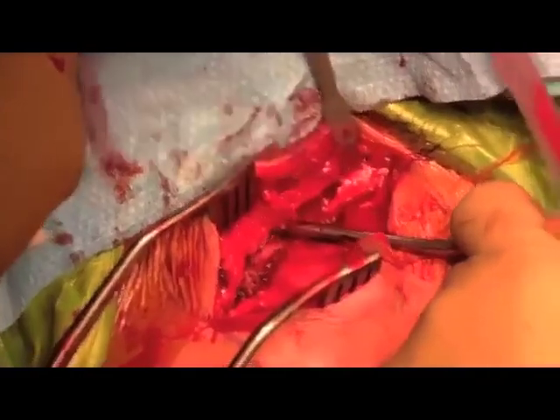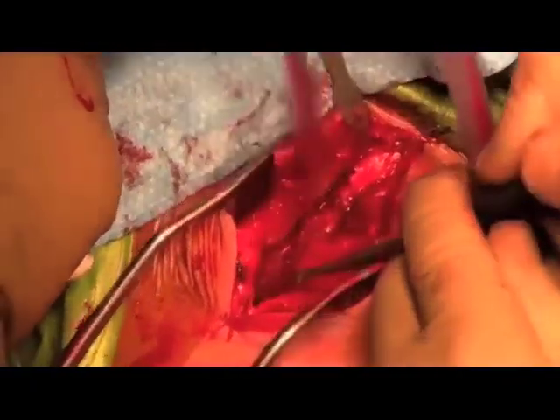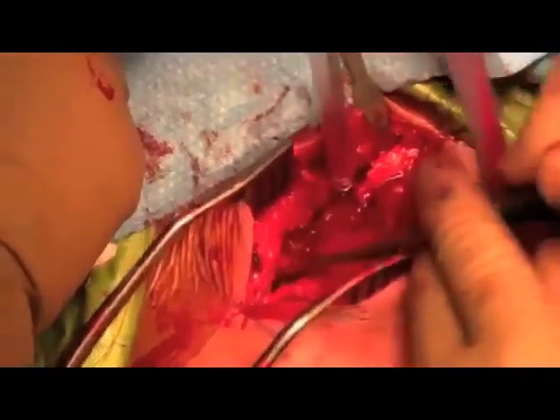A blunt elevator is used to elevate the soft tissue superiorly. Care must be taken to maintain soft tissue attachment inferiorly.